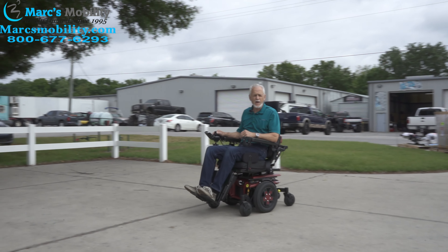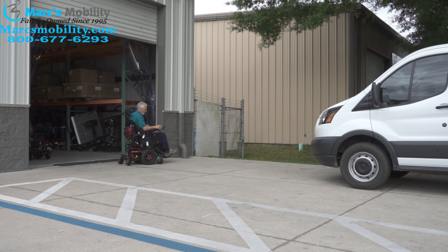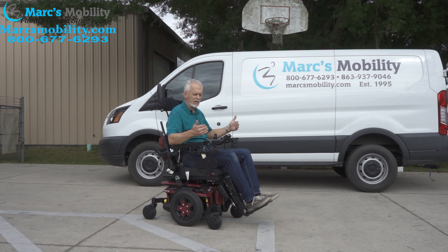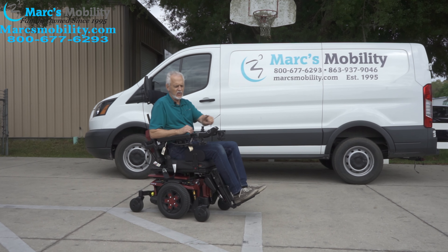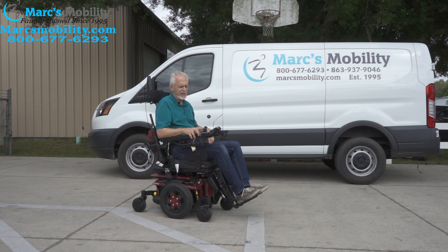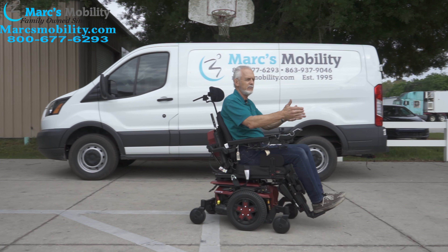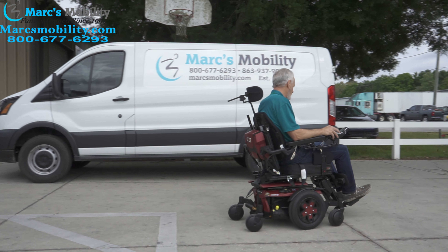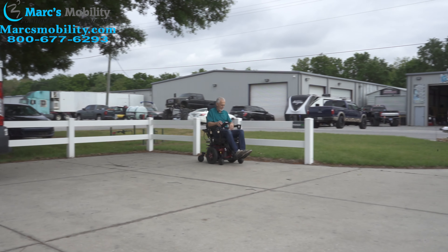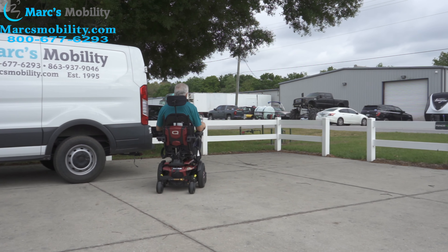This chair runs at 6.2 miles per hour top speed. Really smooth, too. When you stop, the chair brakes automatically. You can control the speed by not pushing the joystick all the way forward, or by reducing it through the controls. If I just move the joystick a little bit, you can see I'm barely moving — but if I push it all the way, it's like a gas pedal. These chairs do well in the grass too.